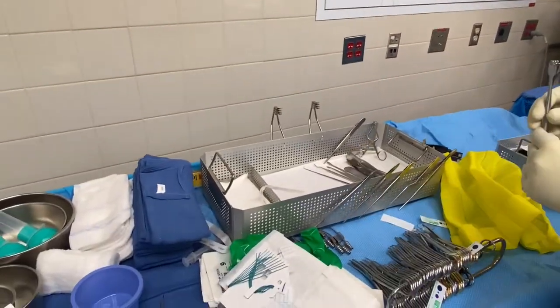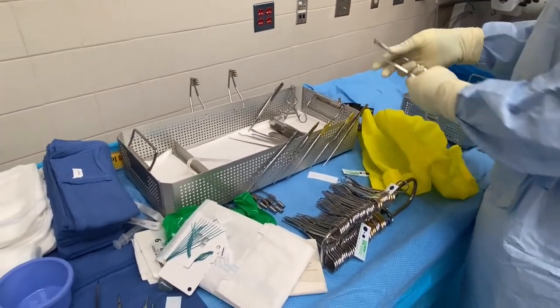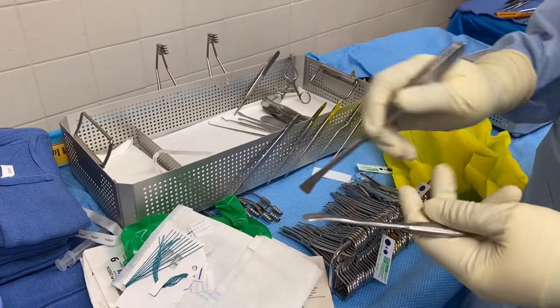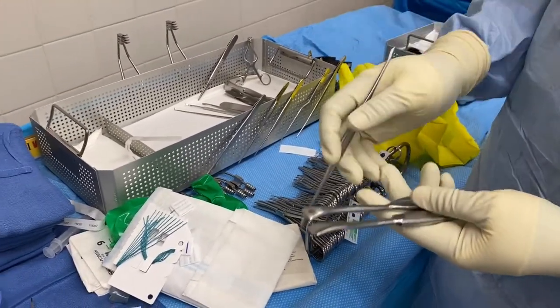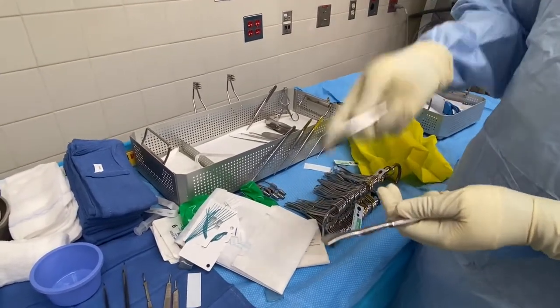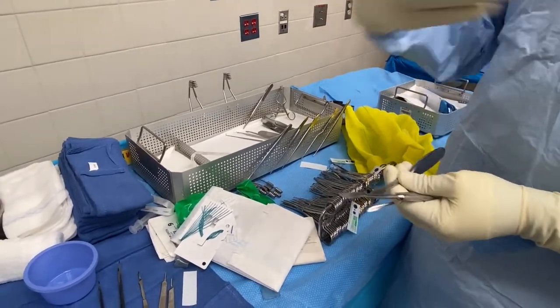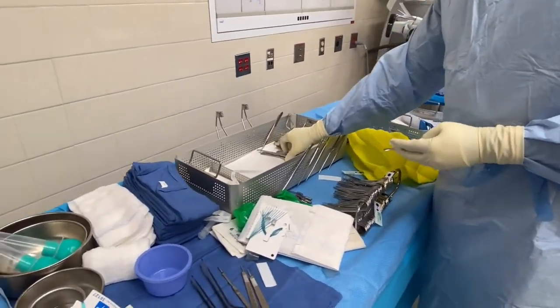These are Senn retractors. These are elevators — you also see them in orthopedics. They serve the same purpose as the Penfield three: sometimes the Penfield three is too small to lift the bone, so they use a heavier elevator to clean the dura from the bone so they can lift it without damaging the dura, because they'll need it at closing to put back the bone for protection.